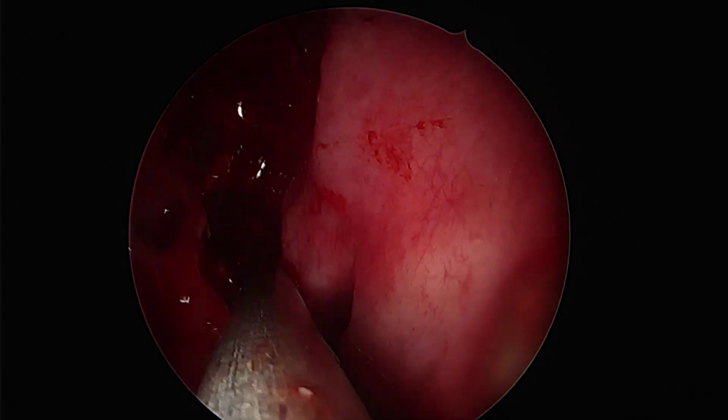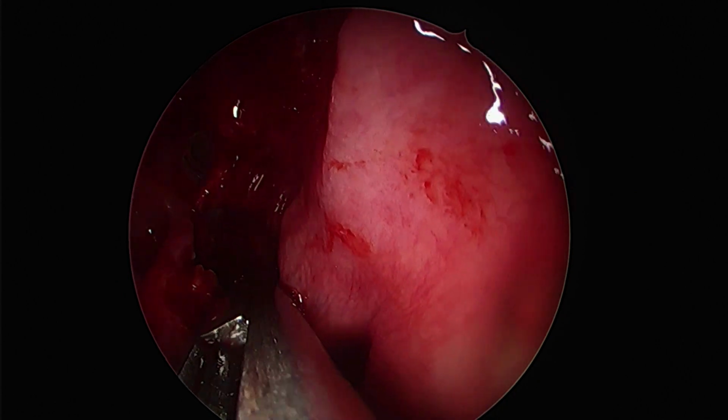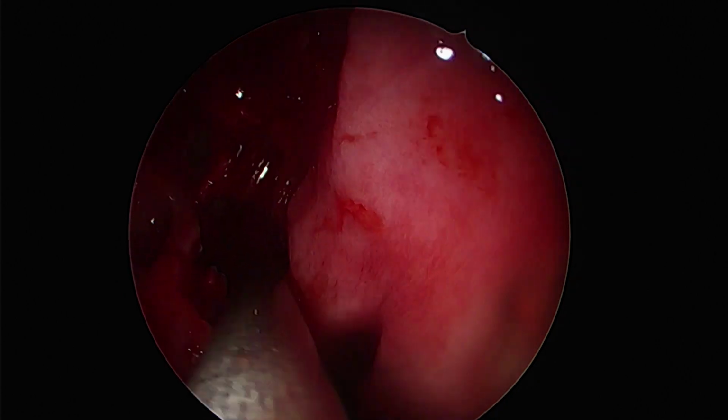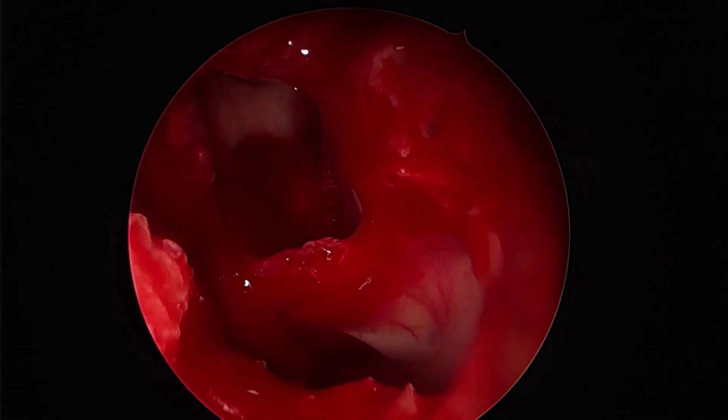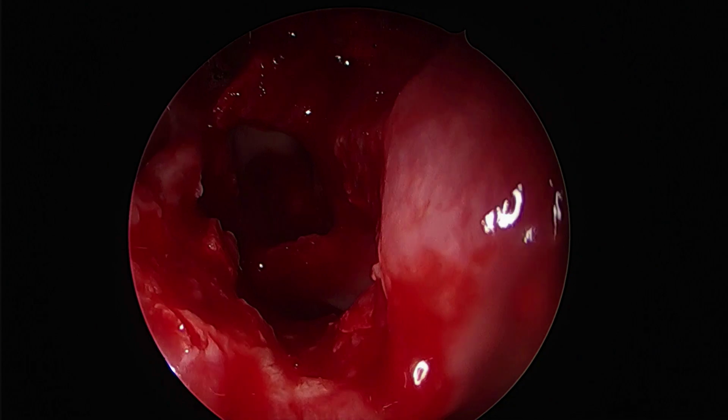So we are trying to remove some more bone inferiorly to obtain a straight trajectory of instrumentation when we go on to remove this near complete septation between the Onodi and the sphenoid.